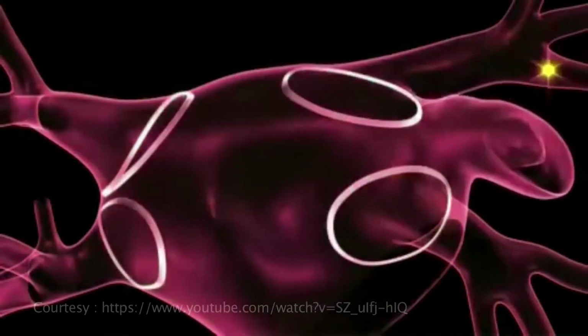Scar doesn't conduct electricity, therefore if there's electrical firing within the vein, that electrical firing can't exit the vein and short out the entire chamber.